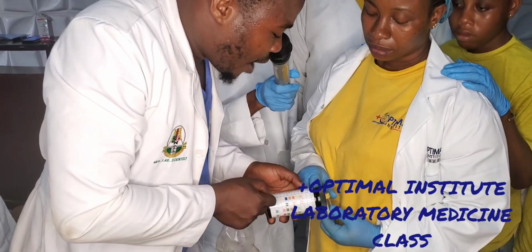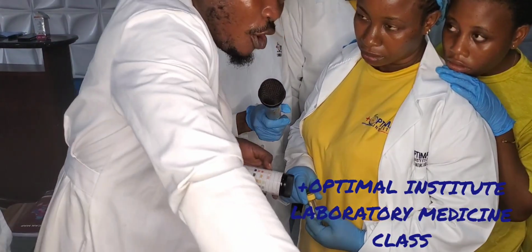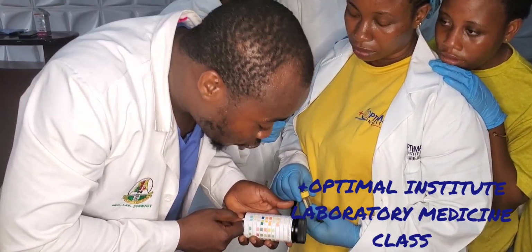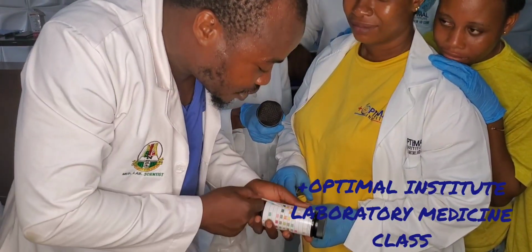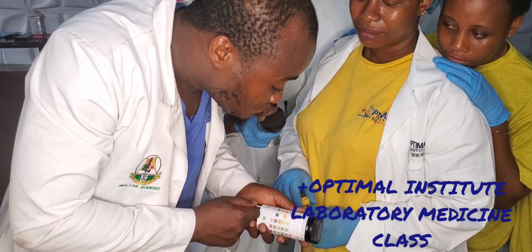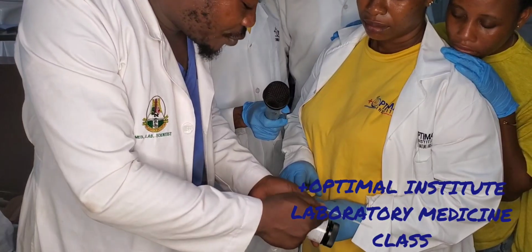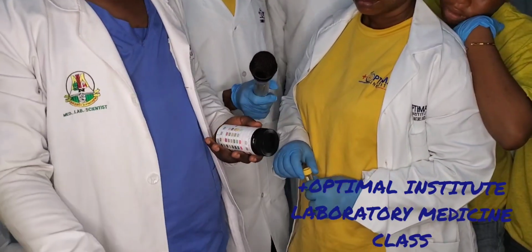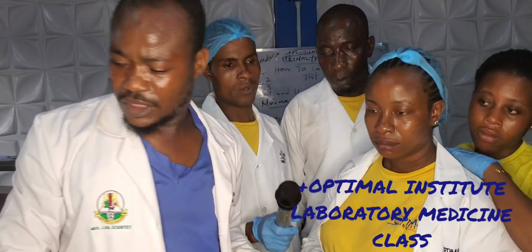Number 1 here is leukocytes. We put it and check immediately for leukocytes, nitrites, hemoglobin. We don't leave it in; we just dip it. When you put it there, some of these things change immediately in the urine. It must match the first one. If it is not matching the first color but matches the second, it is positive. If it matches the first color, it's negative. Except pH and SG. Is it clear?